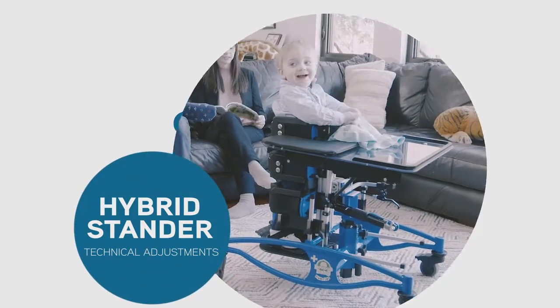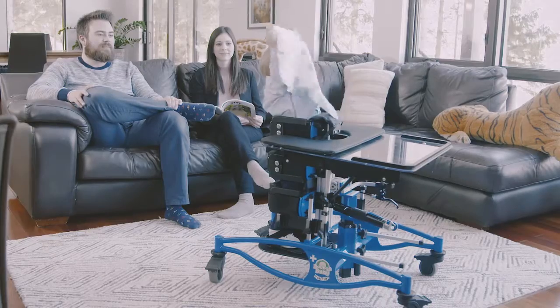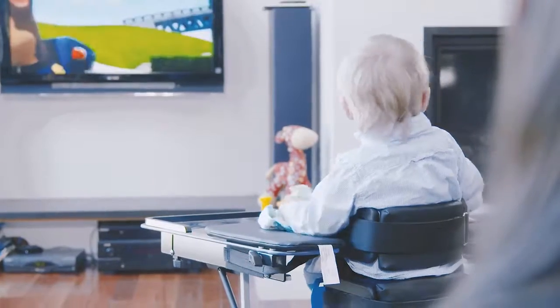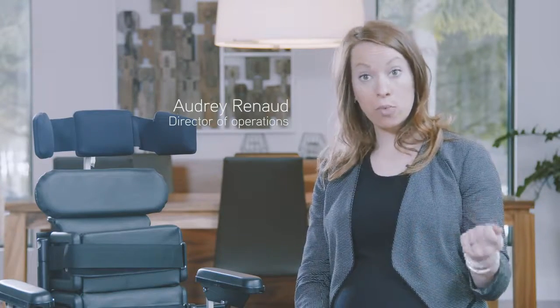The Hybrid Stander offers a variety of positioning angles to the user, from supine to prone and back, as the condition of the user may require. Just a few quick and easy adjustments are needed to convert from one to another.